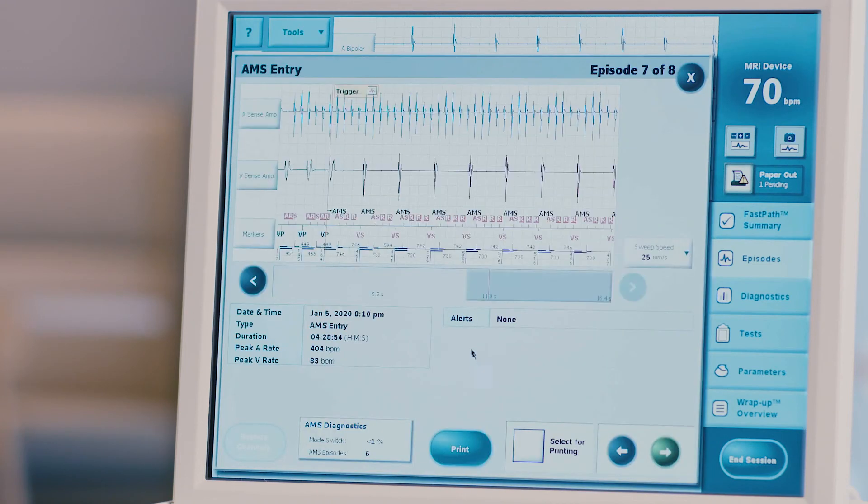The stored EGM will open on the screen and will include all relevant episode data: date, time, type, and duration. You can choose to print this episode now by pressing the blue print button at the lower right of the screen. You can also select this episode to be printed later when you are finished with the interrogation by checking the select episode for printing box at the bottom of the screen.